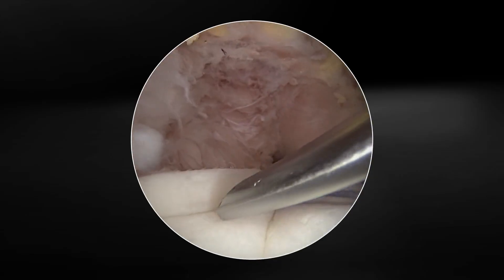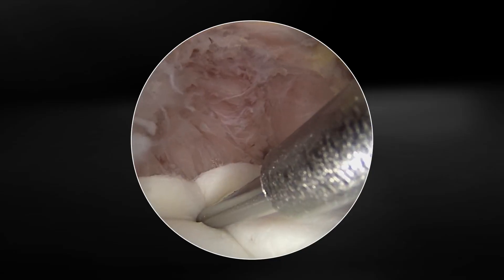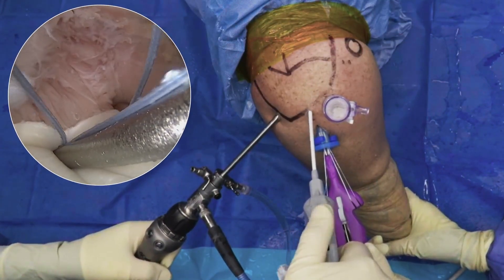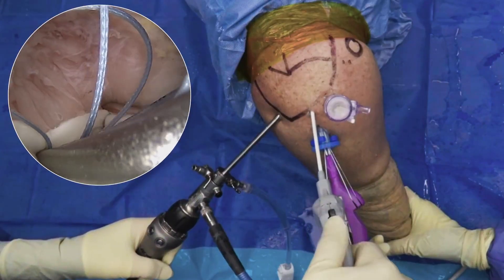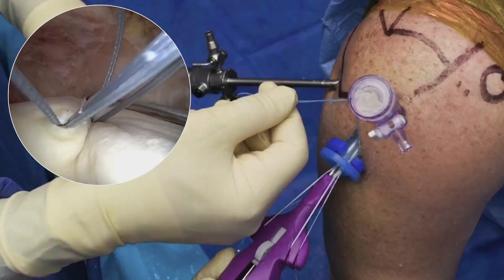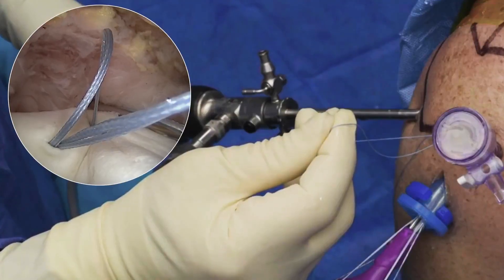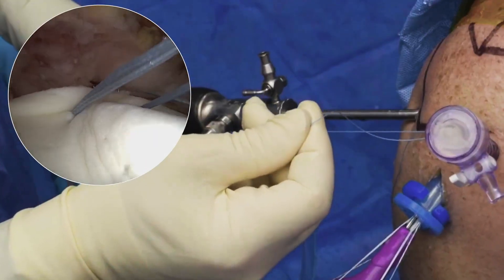A horizontal mattress is created by spreading the implants by about four to five millimeters. The tip is then reintroduced with a gentle pronation and supination moment, and the wheel is reversed until a click is heard, and then advanced again in the forward direction. The implant is secured by gently tugging on all sutures. The horizontal suture is secured against the graft by placing the fingers in the loop outside of the shoulder and gently tensioning it into place.